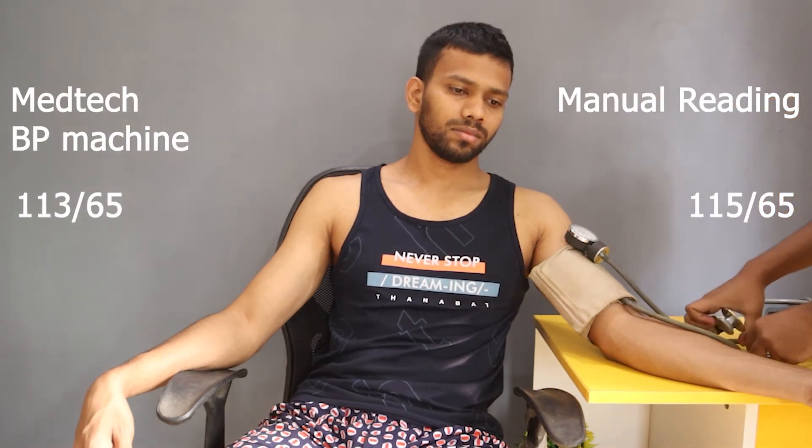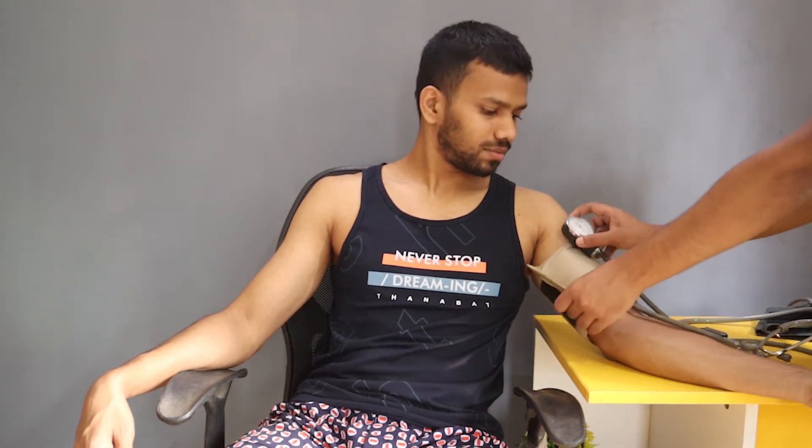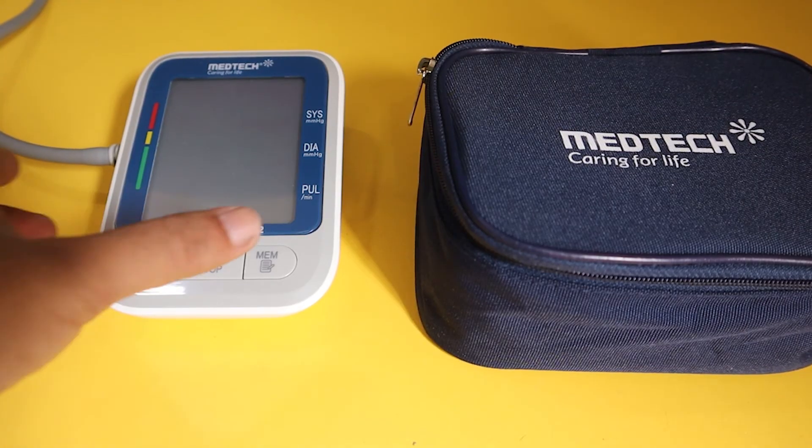The manual reading is 115 by 65. So here is the comparison chart — you can see this Medtech automatic BP machine is quite accurate. Frankly I am impressed, because normally the accuracy of automatic BP machines is not so good, but this one seems pretty accurate.